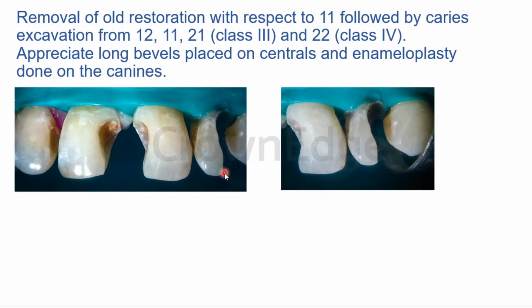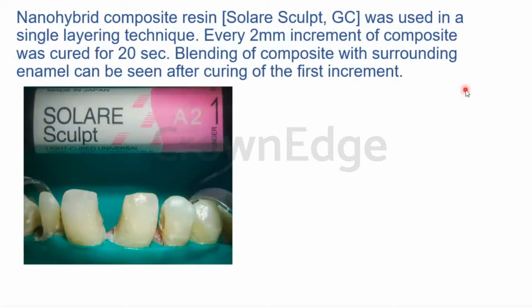Our composite is basically a polymer made out of a chain of monomers. When there is any polymer involved, after curing, after its polymerization is done, it tends to shrink those links between the monomers over a period of time, leading to polymerization shrinkage. And if it gets contaminated with moisture before polymerization, then the shrinkage will be much higher, the bond strength will be much lower, and long term retention and marginal integrity will be lower.